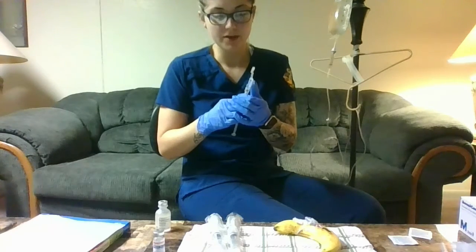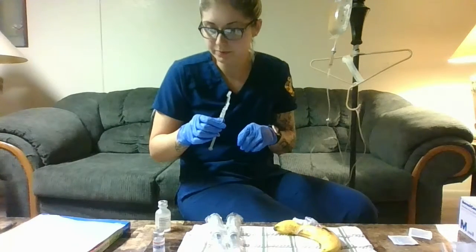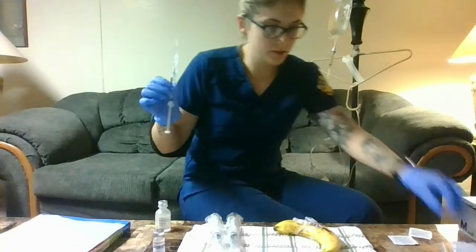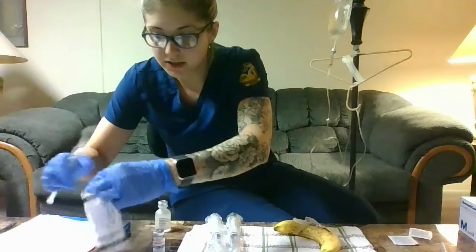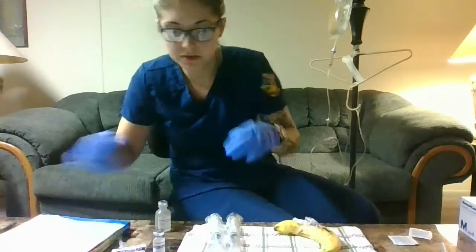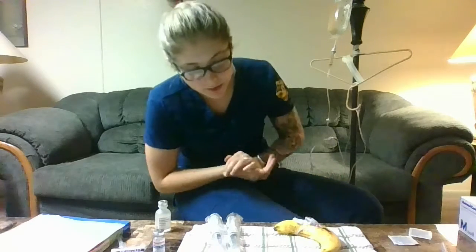We can cap this needle here because we won't need the top of the needle anymore. So we can actually just set it inside here because it's still clean. We can set it on the patient's table. We're going to knock on their door, introduce ourselves again, hand hygiene, 2 patient identifiers, last name, date of birth, at their wristband. We're going to tell them what we're doing.